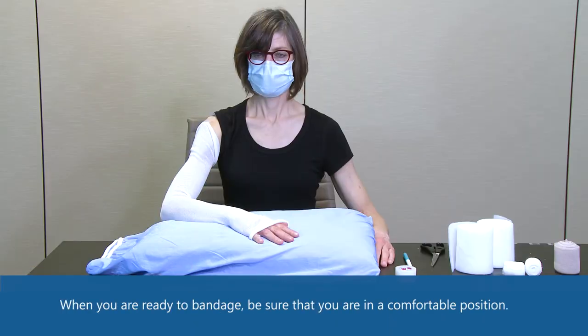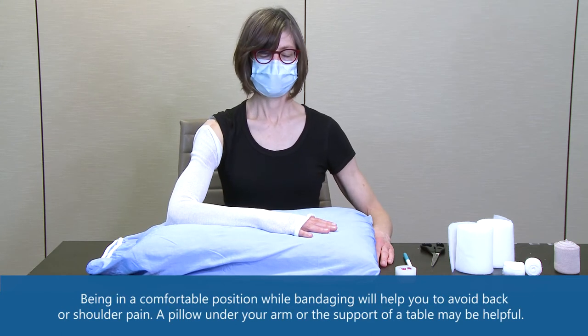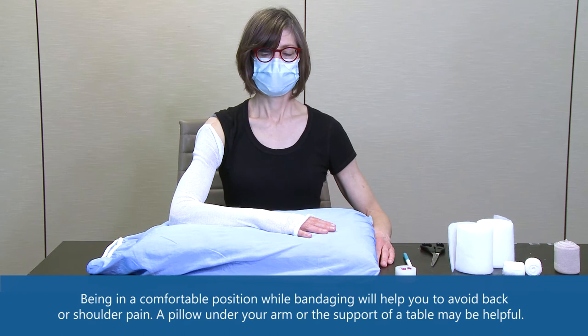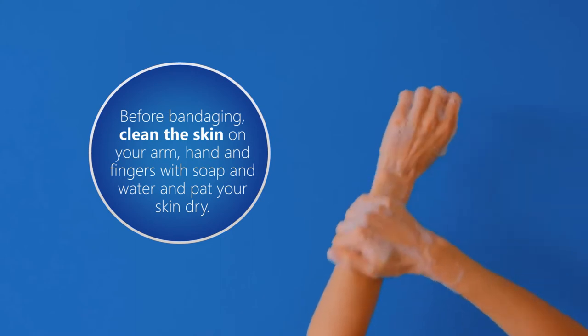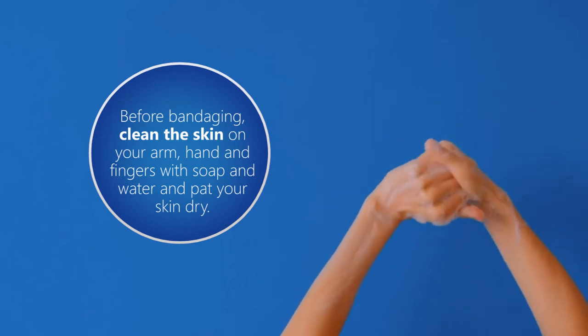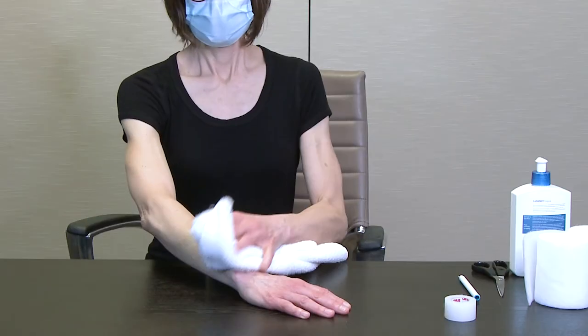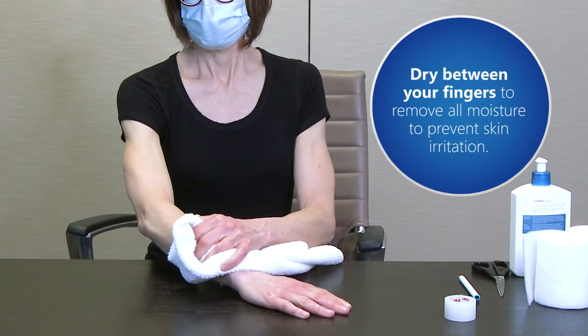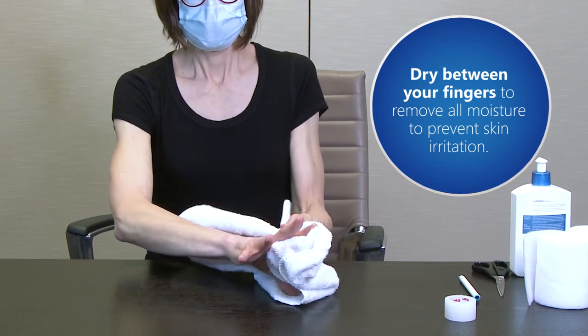When you are ready to bandage, be sure you are in a comfortable position. Being comfortable while bandaging will help you avoid back or shoulder pain. A pillow under your arm or the support of a tabletop may be helpful. Before bandaging, clean the skin on your arm, hand, and fingers with soap and water, then pat your skin dry. Make sure you dry between your fingers to remove all moisture and prevent skin irritation.